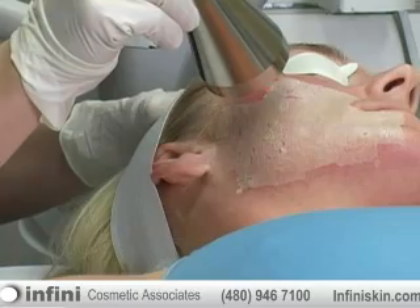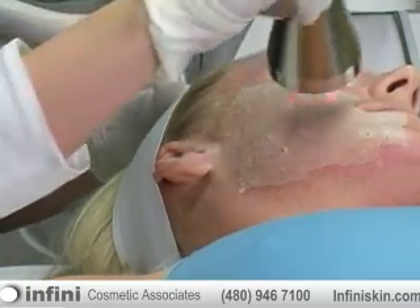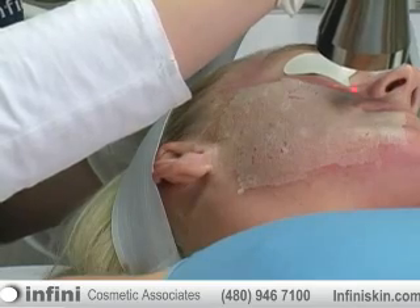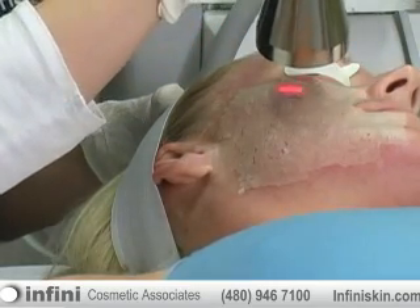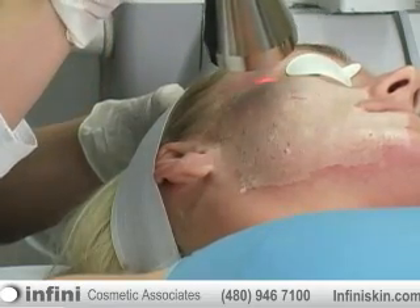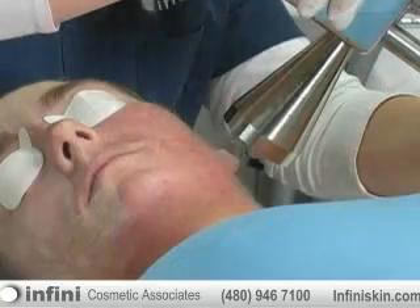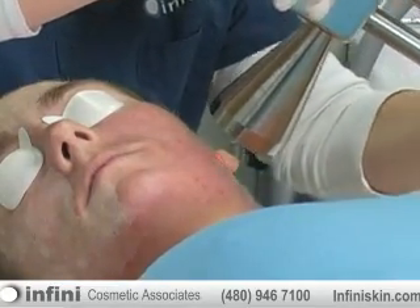Here at Infini, you can see that we really concentrate on patient safety, with protecting the eyes. When we get up around the eyes, we really try to get close up underneath the eyes and around the sides of the eyes to get up on the crow's feet and find the wrinkles that really pester people right around their eyes. Now we're on the other side, ablating or burning off those superficial layers.